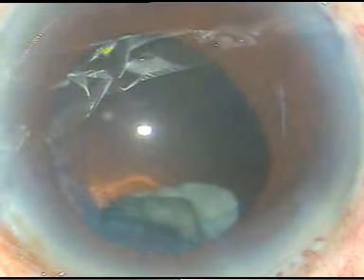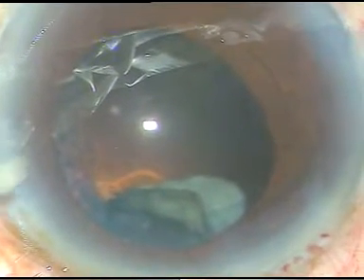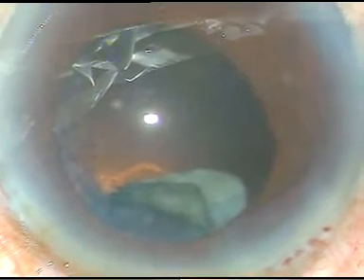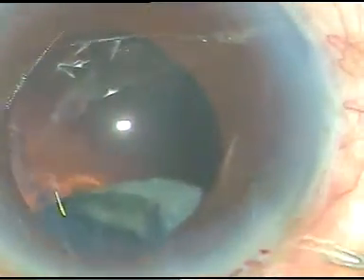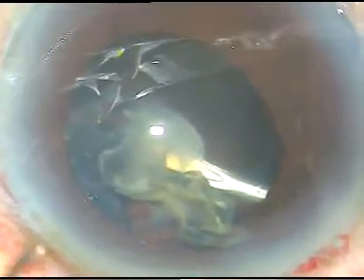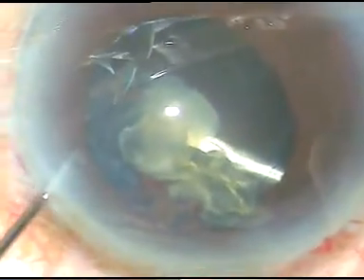What to do now? I take a 24 gauge needle, and I inject the needle about 3 mm behind the limbus and support this epinuclear material from behind, and I use the chopper to mobilize it, to bring it in the anterior chamber.